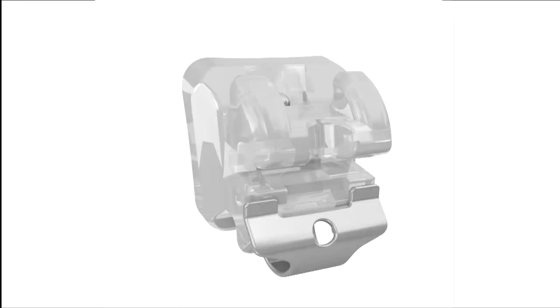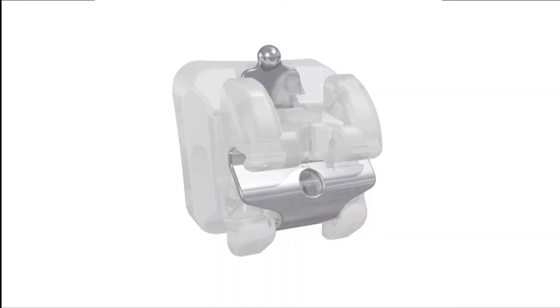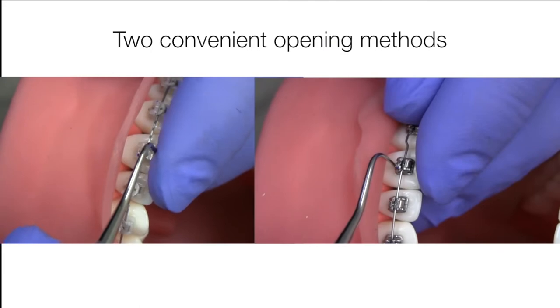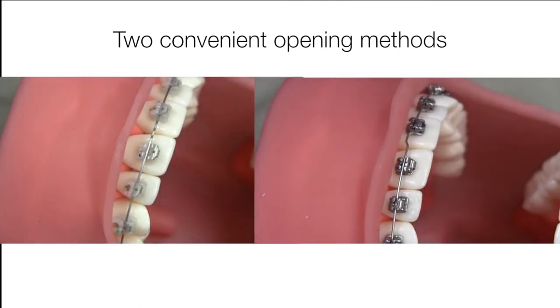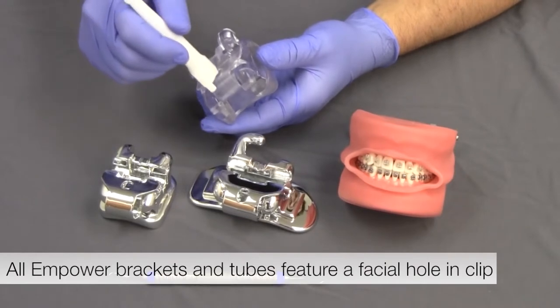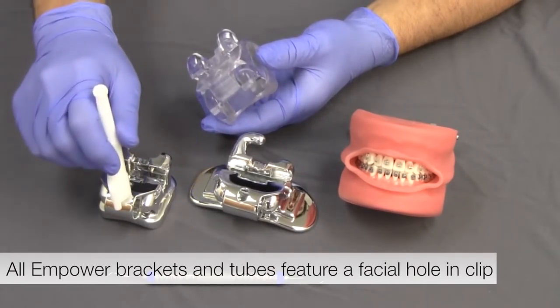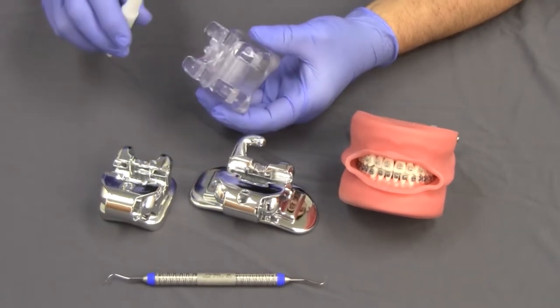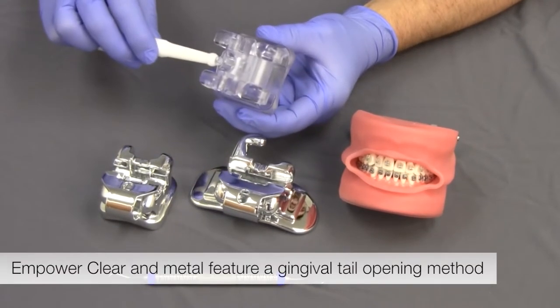Empower clear interactive brackets round out the Empower self-ligation family and offer patients the aesthetic choice they're looking for. Empower offers two convenient opening methods allowing you greater flexibility depending on bracket accessibility for patient hygiene. All Empower brackets and tubes feature a facial hole in the clip. Additionally, Empower clear and metal also offer an opening method accessing the gingival tail of the clip.